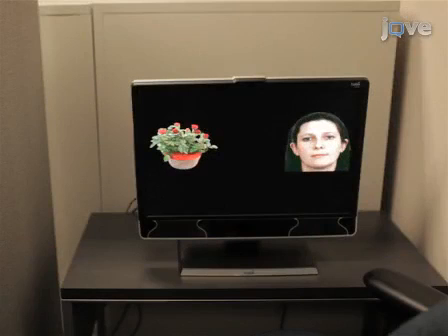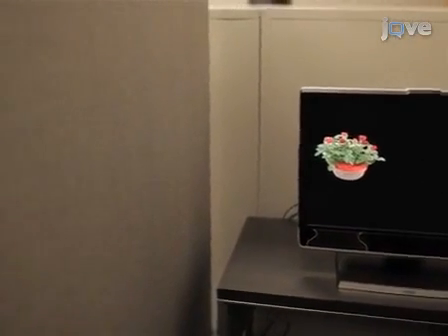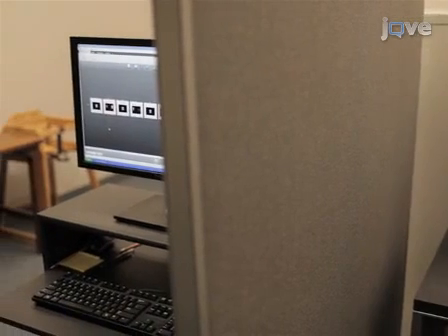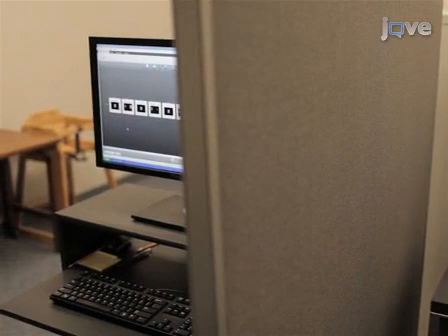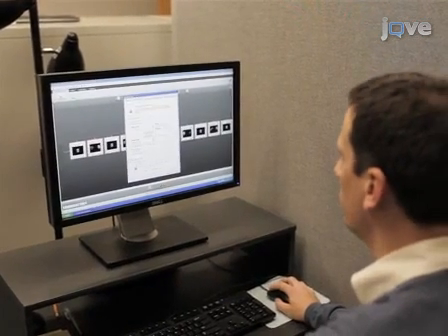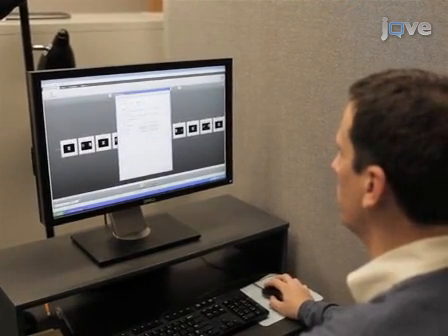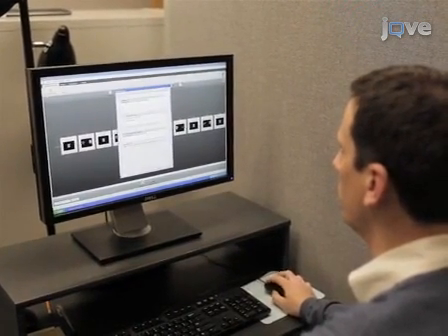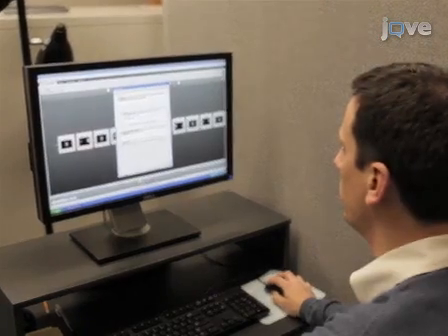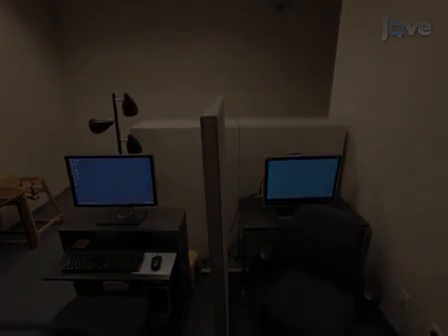When testing young children with autism spectrum disorders, it is best to select an eye tracking system that accounts for head motion, but that does not restrict the head or require minimal head movement. Systems with a sampling rate of at least 50 Hz are adequate to examine scanning patterns, but a higher sampling rate of at least 250 Hz is recommended for investigating subtle oculomotor behavior. Sparse room decor is recommended in order to minimize distraction.